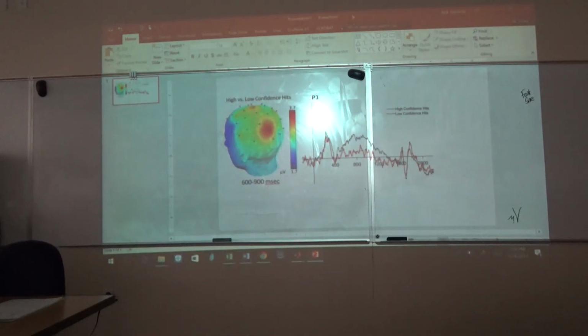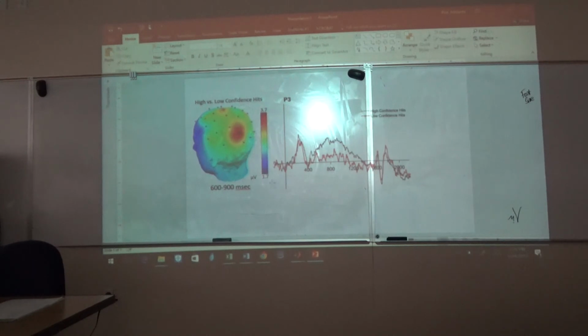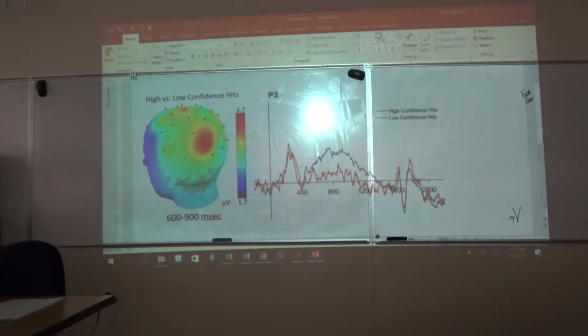Okay. So we grab that box. And we were analyzing basically 600 and 900, which would be about there.